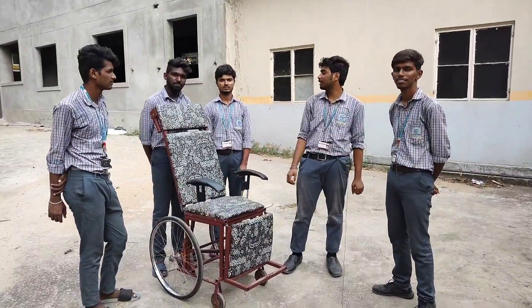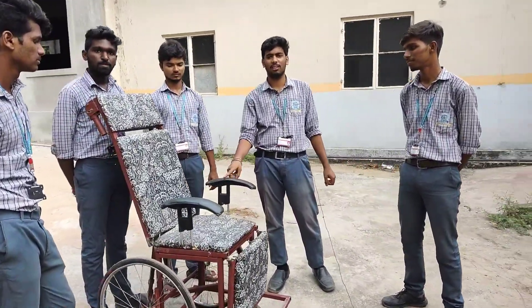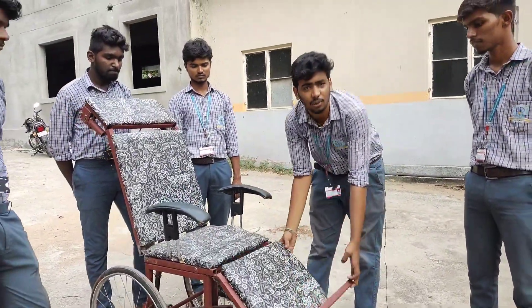Coming to the project, firstly I would like to explain about the components. This is the armrest where the hands are held, and this is the legrest where the patient can keep his legs to its comfort zone.